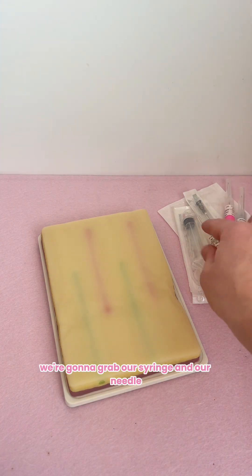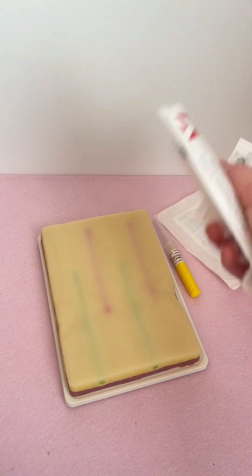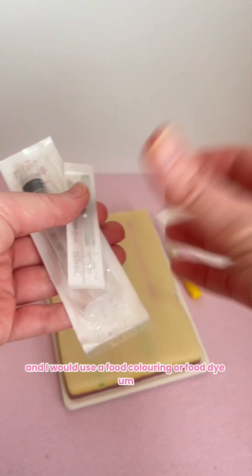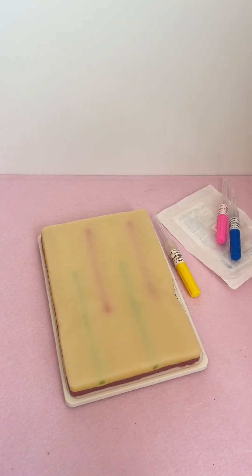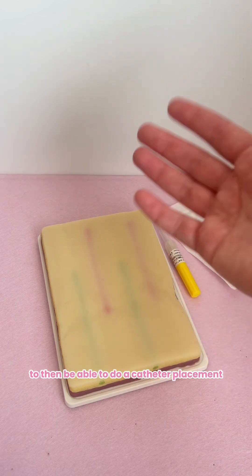First of all, we're going to grab our syringe and our needle. I would use a food colouring or food dye for the liquid we're going to use — that acts as the blood, and that is what we're going to fill the veins with to then be able to do a catheter placement or a blood draw.